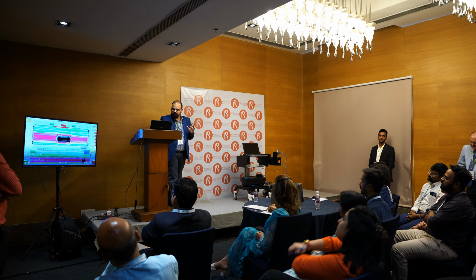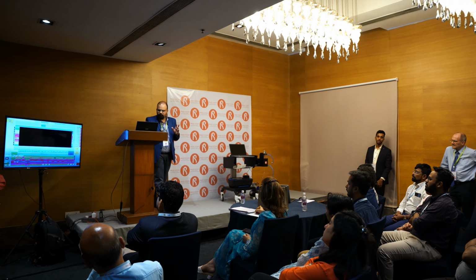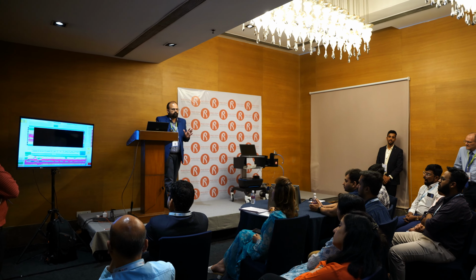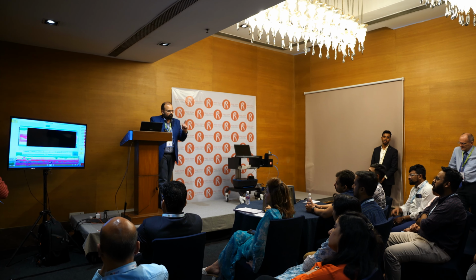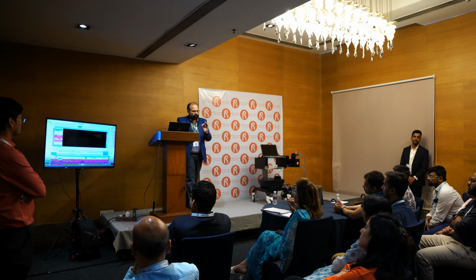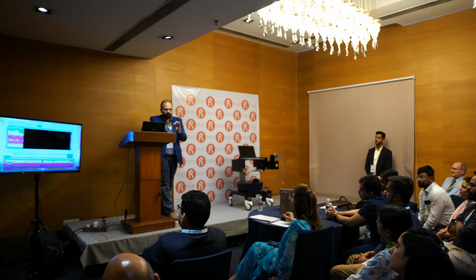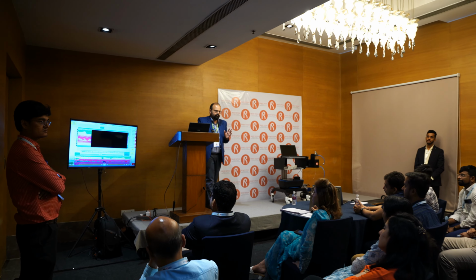So the first thing I would definitely want to see is how is the tone. Like in this patient, I expect a good tone. So as soon as I put my catheter in and I know the tone was nice, I like to see this kind of image.